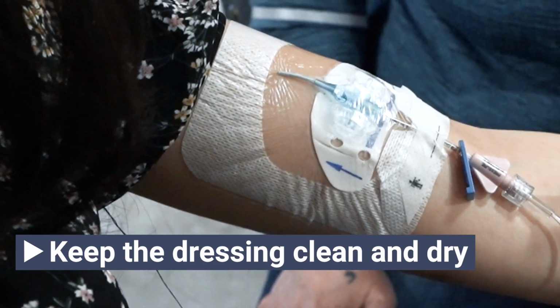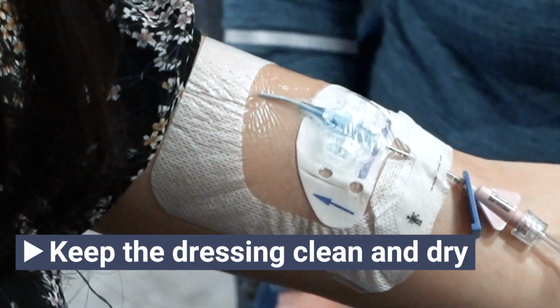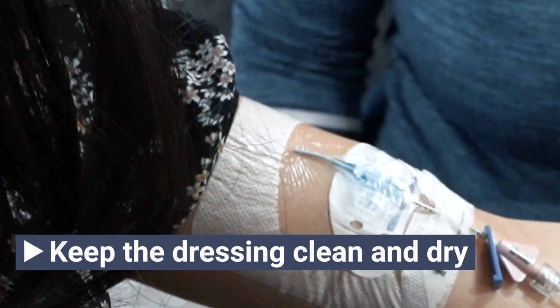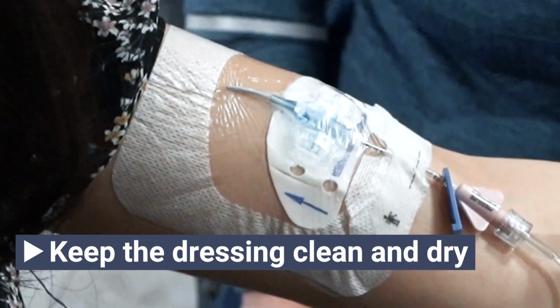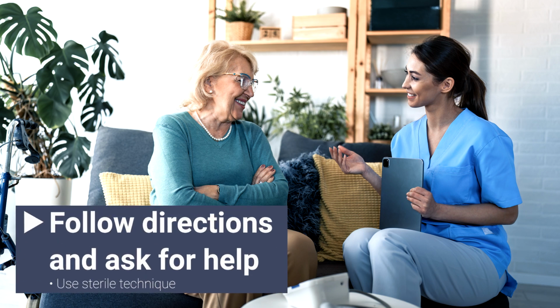Keep the dressing clean and dry and keep it away from anything that could make it dirty. If the dressing becomes loose or soiled, let your home infusion agency know right away, as it will need to be changed. Most IV line dressings are changed once a week. Usually, this should be done sterilely by your nurse. Your nurse may teach you or your caregiver how to change the dressing. If your nurse has taught you how to change the dressing, be sure to follow the instructions exactly and to use sterile technique. When your therapy is finished, talk with your doctor about whether you still need your IV line.